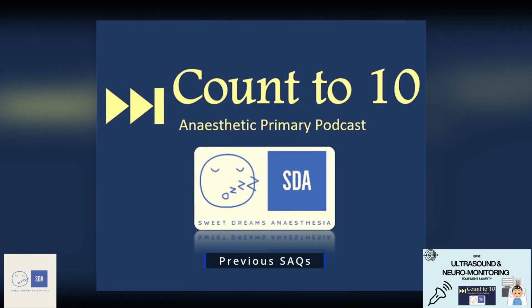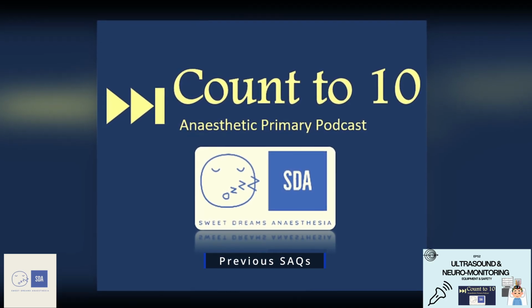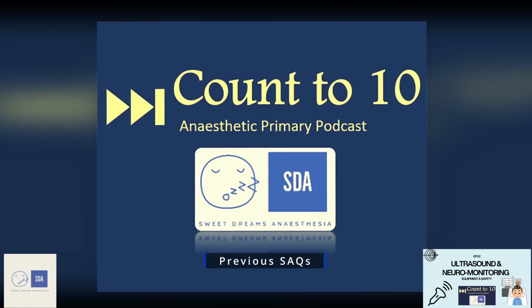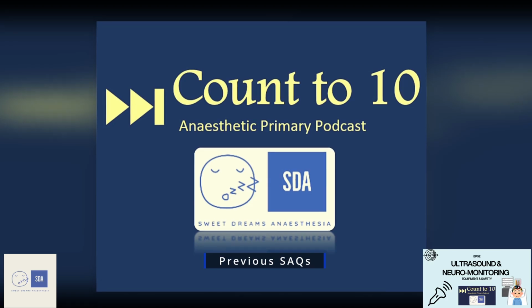But the only reason we know that's the pleura is that you have the air, which because of its high acoustic impedance mismatch with the pleural tissue, leads to it being an anechoic area, therefore black on our image, so we know that that border must be the border between the pleura and the aerated lung beneath it.